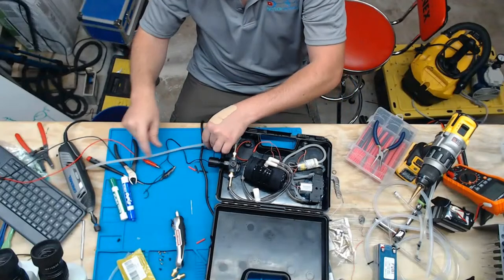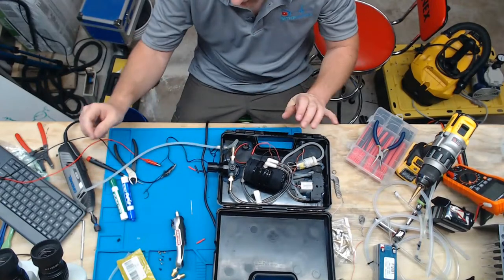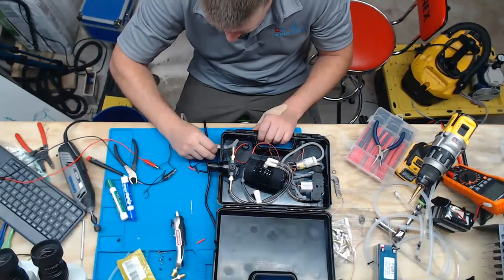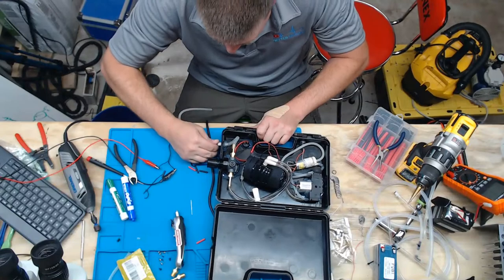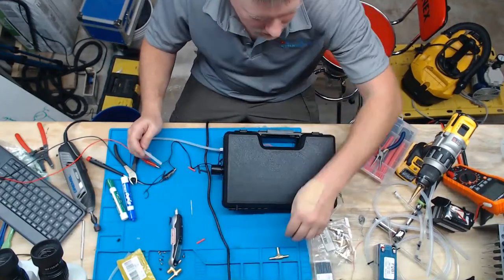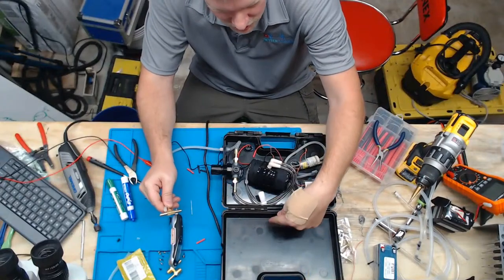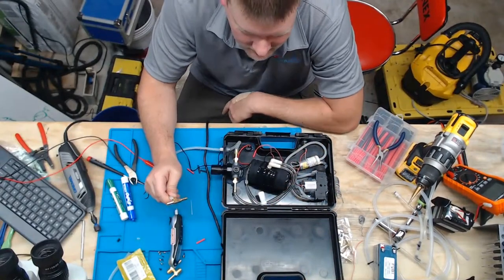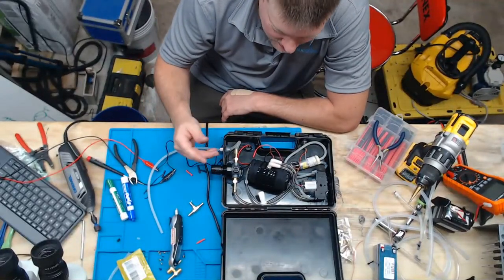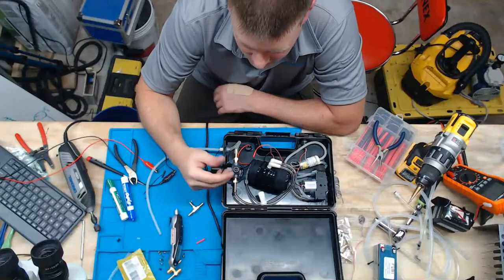So like I said, you're going to have your test hose that comes off of this port. Now this is a luer lock fitting, so there's a lot of test jigs that'll automatically just twist and connect onto it. But for me and for many biomeds, we just shove the hose on it. And then it's going to have a T fitting like this guy, and then it's going to tee off to the digital manometer and then off to the device that's under test. And you are going to adjust the air pressure using this guy right here up and down to whatever the air pressure is the device is looking for to calibrate.